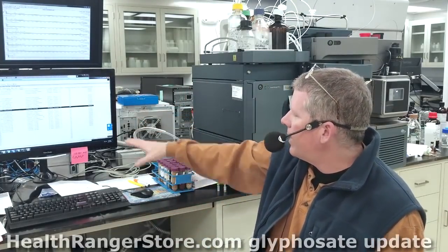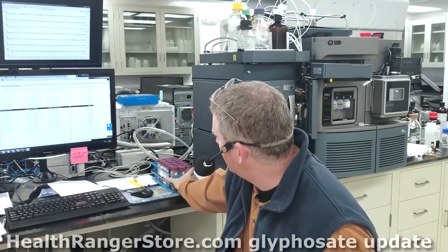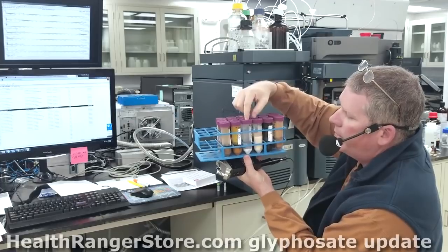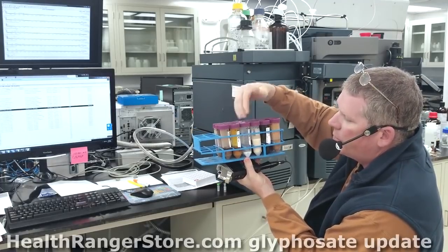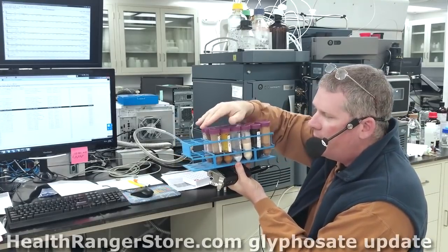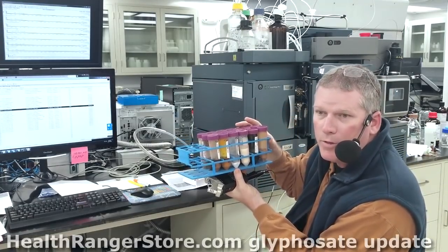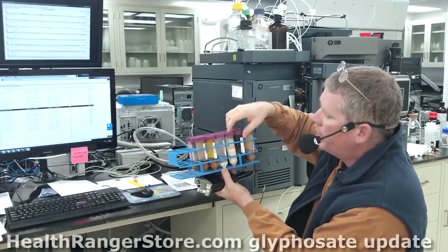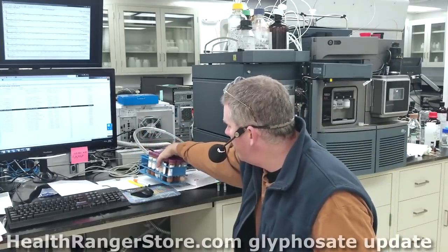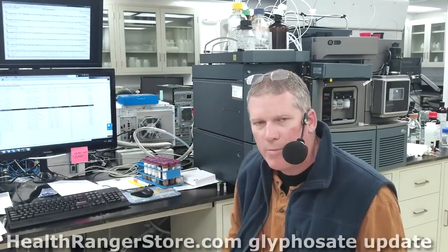We're running samples right now. These are actually some of the samples from our store right here with the lot numbers. These are pre-filtered, but they are prepped using an extraction method that extracts glyphosate, which is a very unique analyte. Everything's labeled with the date, the sample number, the lot number, how many grams, very precisely measured using an analytical balance, of course, plus a certain volume of methanol in this case that we're using as an extraction liquid.